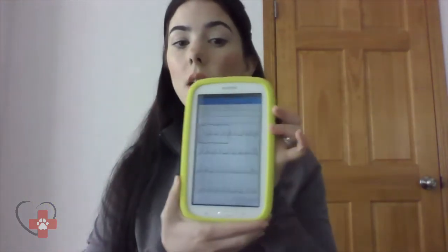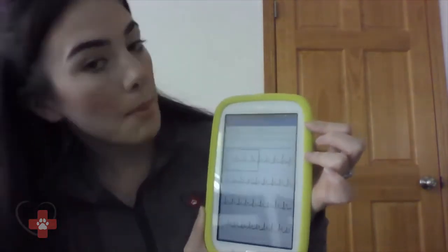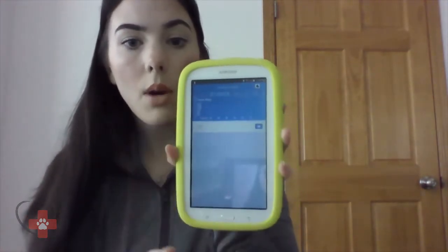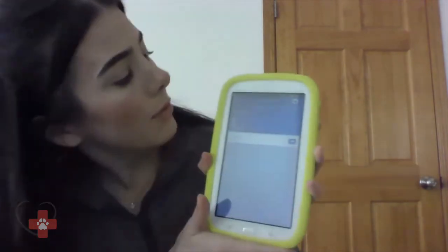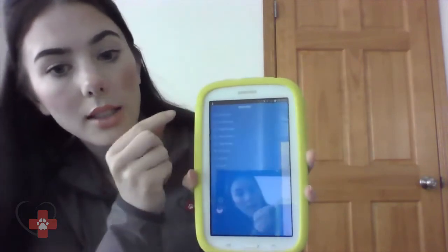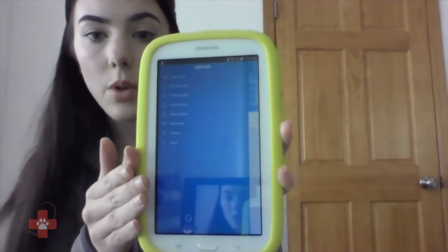Now that we have downloaded our daily check recording, I'm going to show you how to download your ECG recording. To keep it organized, ECG recordings are kept in a different location within the Vet Quarter Connect app. I'm going to hit the back button to escape this screen and go back to the main screen. In the upper left-hand corner, you are going to select the three lines, which will bring up a list of options, and we are going to select ECG Recorder.